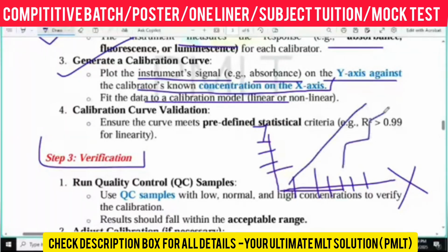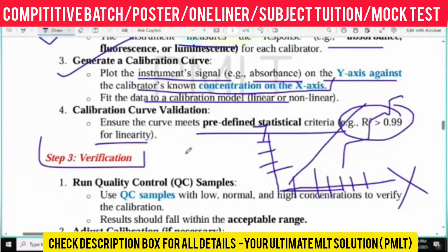Getting my point? After that, the calibration graph should be formed, with a predefined statistical R square of more than 0.99 for linearity. If it's linear, then R square should be higher than 0.99. If it's lower than 0.99, then your calibration is not done properly, and you have to run the calibrator or run the calibration properly again.